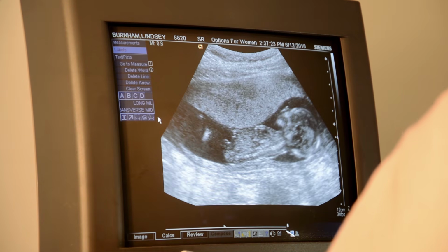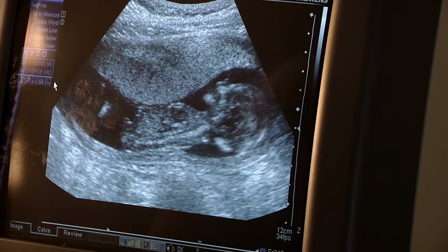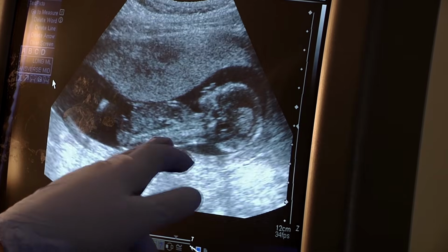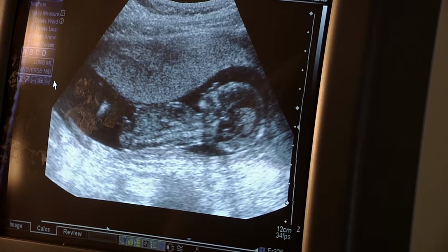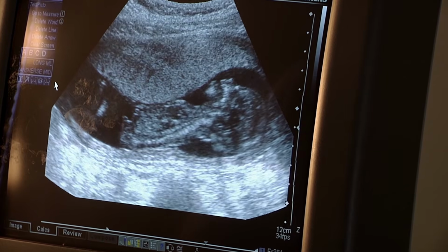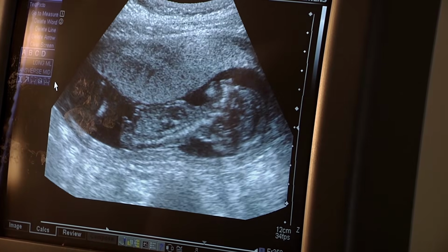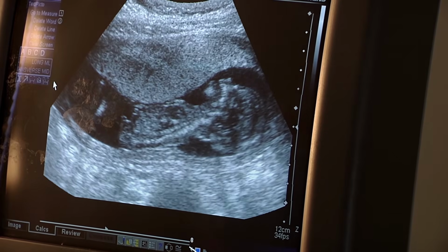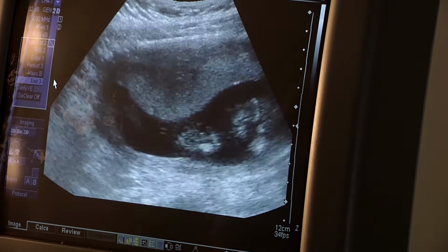Don't you see that? I see. Look at that. Put his head down. When his head comes up, you can see him yawn. Oh, he's so cute. There he's closing his mouth. Do you see it? Now here we go again. Opening his mouth. Oh, I saw it. And now he's raising his chin. Oh, that was a good one. Did you get that one? Cool. I'm crying over a yawn. Huh? I can't help it.